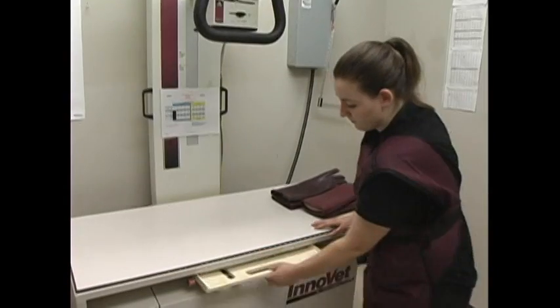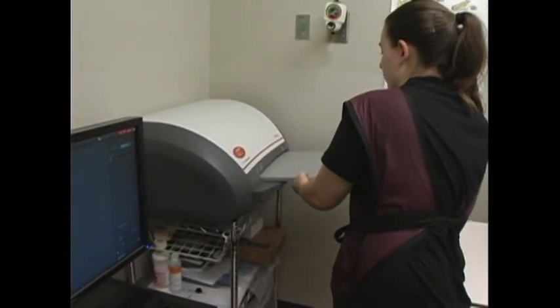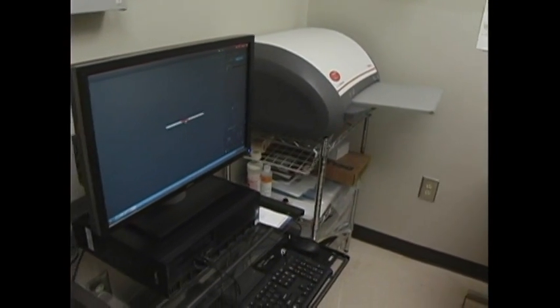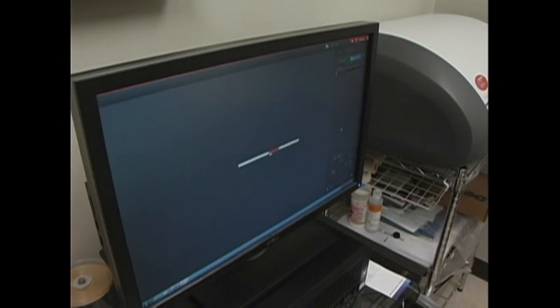Let's turn off the lights so people can appreciate that. There we go, and keep talking. Remember, she's a little nervous, so you need to reassure her. There you go. And then, we always take it on exhale, so Kristen touches the film and takes it. It takes just like that. All right, see, very good. Excellent, good job. Okay, now we've taken the radiograph, and all we have to do now is take the plate out and put it into the digital processing. It's so easy. You just push it in there, and it's fed into the processor, and it's really remarkable. And then within a short period of time, it will actually put the image on the screen.